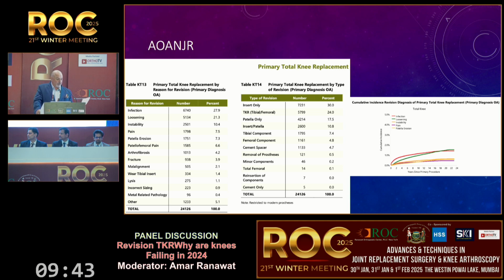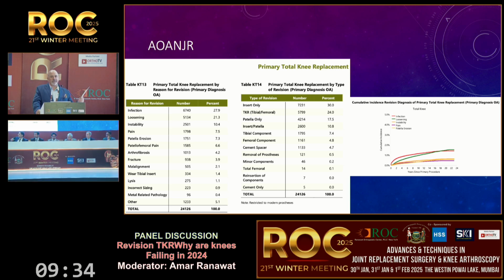I think you're absolutely right. We all have seen some companies that have had terrible polys, but by and large, the materials are getting better. We spoke yesterday about the possibility that in the near future, chromium and cobalt will vanish in the total knee world, and we'll go to different materials. So maybe things like hypersensitivity reactions will be less over time. But there was a recent 10-year data published with simple poly and the highly cross-linked poly. They could not find any difference as far as loosening is concerned. It was published last year.